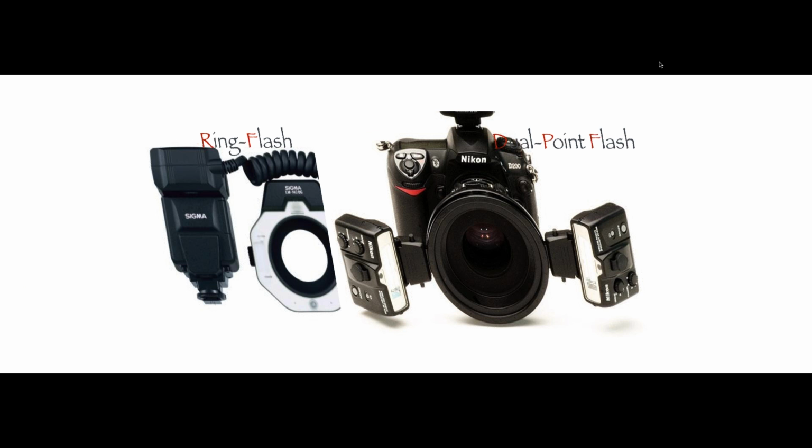Why? Because a ring flash is going to be good for frontal view, for anterior teeth, for posterior teeth, for full face photos. I mean, it's a flash that's going to be good for many shots. On the other hand, the dual point flash is a great flash. It's an expensive flash, but it's only good for aesthetic photos. So you can only use it to take the smile photos, the front teeth photos. It's very hard to take photos with this flash of lateral views or occlusal view of posterior teeth.